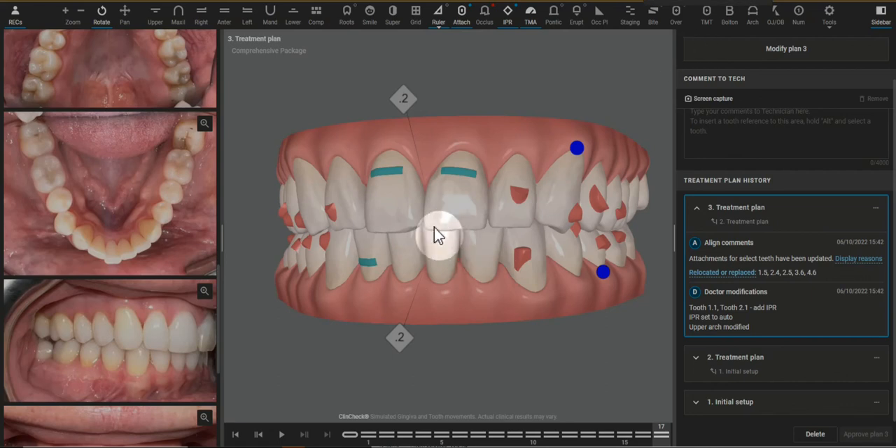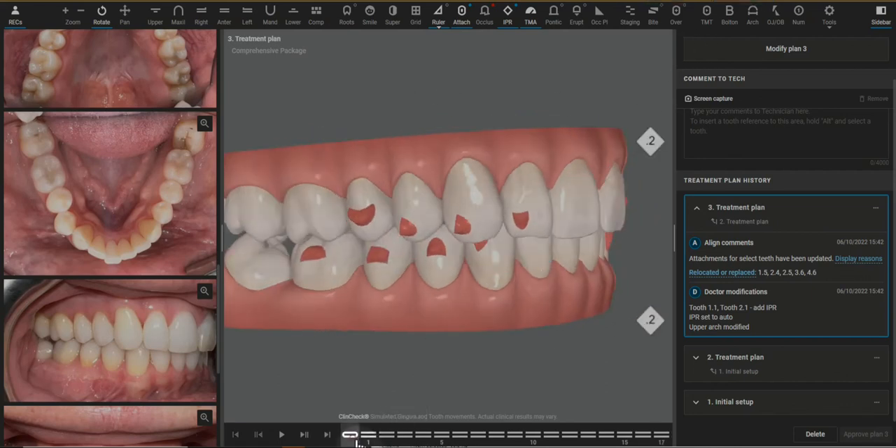Hi doctor, I'm looking at David's case and just wanted to talk through some of the changes that I'm going to make — things that you're probably used to seeing.